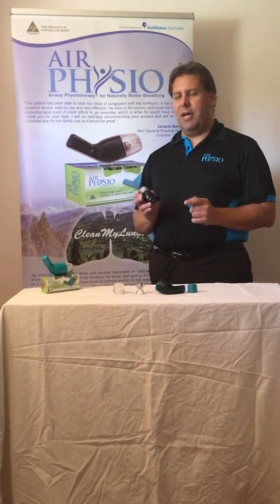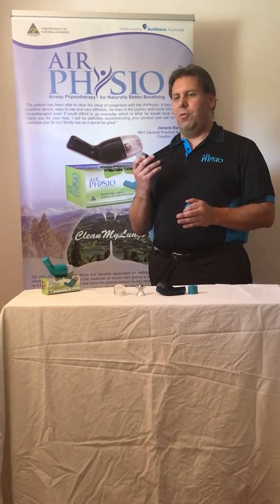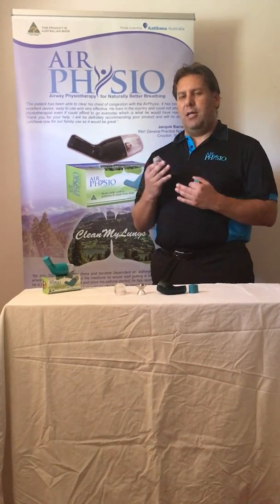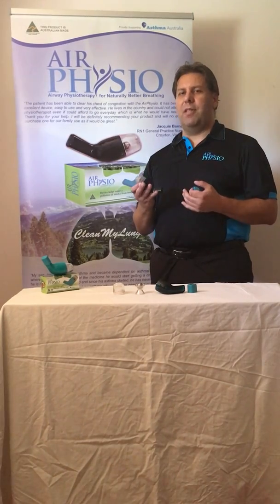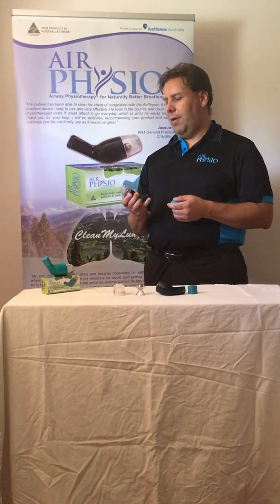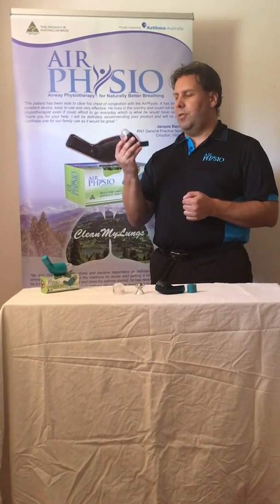PEPs have been around for ages. Some of them are called bubble PEPs, and what they do is you blow into the device and it creates resistance so that the air inflates your lungs, opening the airways up and loosening any blockages. They're used to reinflate the lungs, usually after surgery and recovery. Now all you do, just like the PEP devices, you actually blow into it.